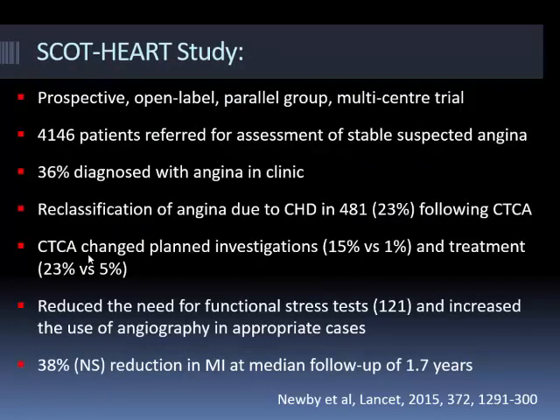Okay, so going back to SCOT-HEART, which is another very good study. This was basically just looking at how we could use CT angiography in the standard clinic approach. So basically patients were recruited, you do the traditional risk, you take a history, assess their risk factors, put them on the treadmill, and in a subset they then went on to have a CT angiogram kind of blinded to the referrer.